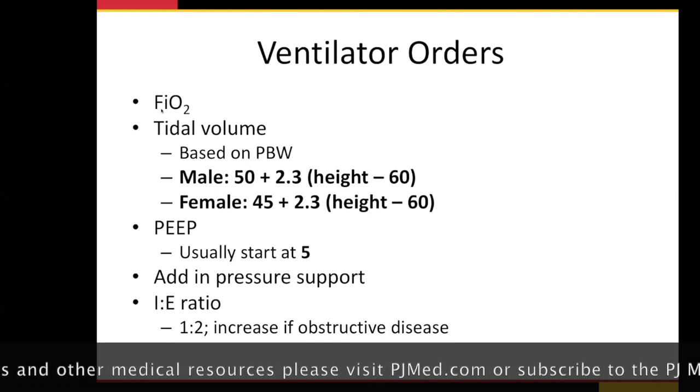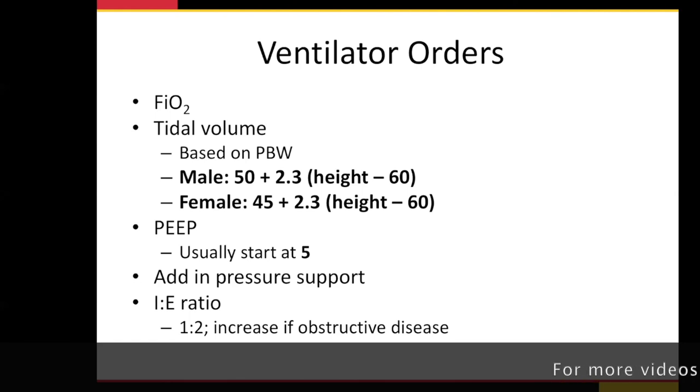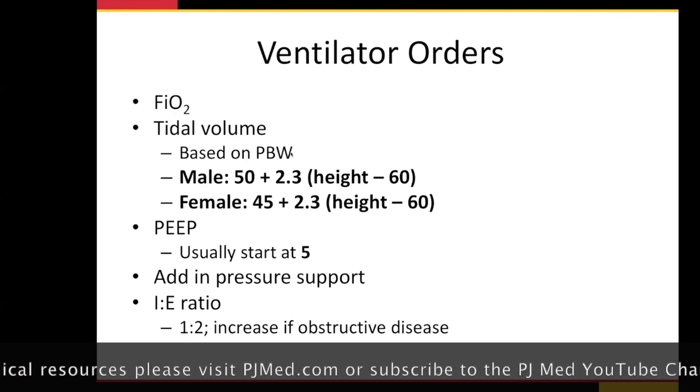This is not the time to worry about hyperoxia with these patients. What we're seeing with the COVID patients are, you guys have read this, they're profoundly hypoxemic to start. So if I'm going to intubate someone and put them on the vent, they're getting 100% FiO2 until I get that first ABG back, okay? Then I'll back off the FiO2. So 100% to start.